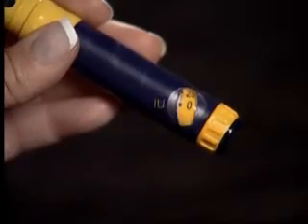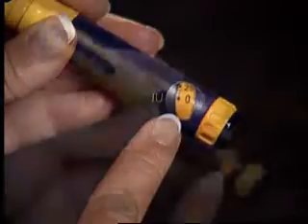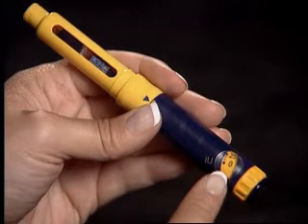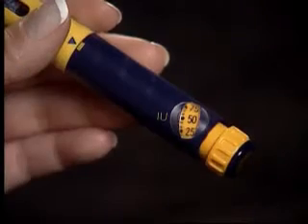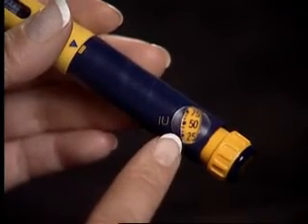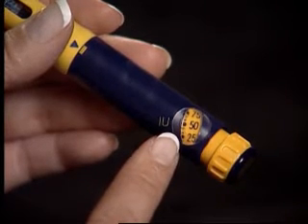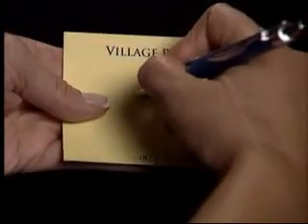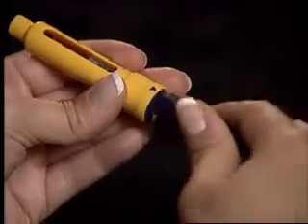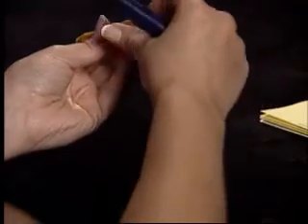Always check the dosage window after an injection using the Follistim pen. If the dosage window reads 0, then you have received your entire dose. If the dosage window does not read 0, this indicates that you did not receive the complete dose and that the cartridge is empty. Document the amount that appears in the dosage window. Remove the used cartridge and needle and replace with a new cartridge and needle.